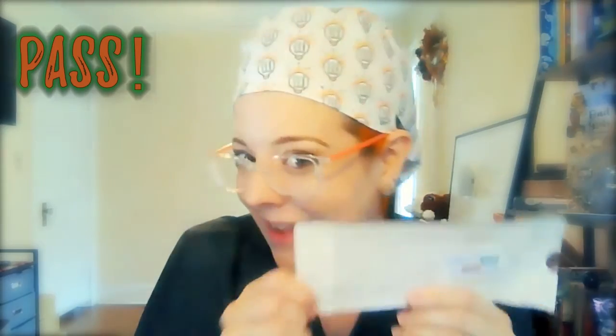See, there's a space right here. Alright guys, I finally got a good one — there's no holes, there's no wrinkles, there's no bubbles. But can we take a second to appreciate the integrator inside of the peel pouch? This particular integrator is a Class 5, and I wanted to be sure that it is face up so that the individual opening the peel pouch can read the easy pass/fail, and when they're opening it and dropping it on their sterile field, they can be certain it's going to have the best quality for the patient they're about to use it on.